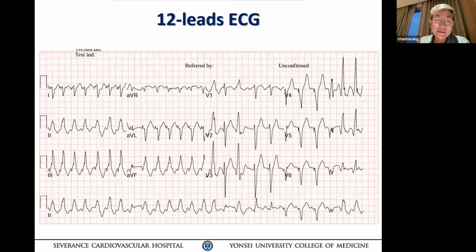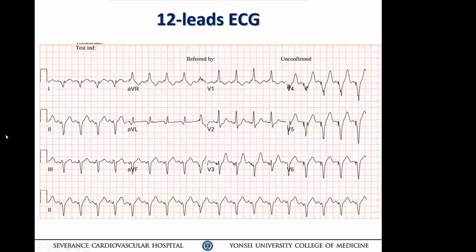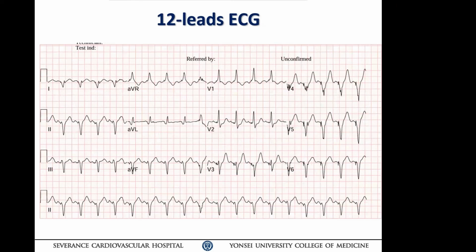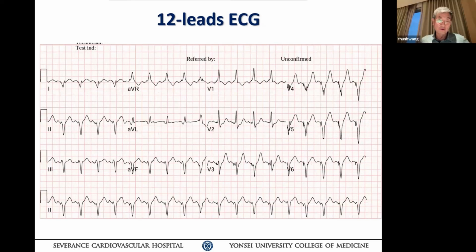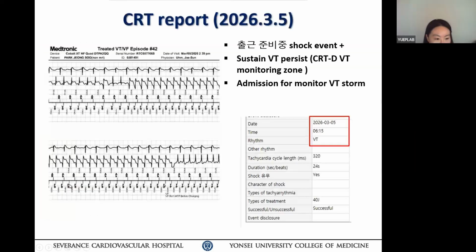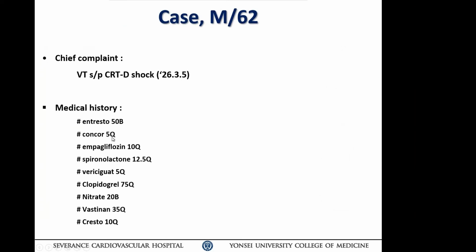Can we see the next ECG? Okay. Yeah, this is a sinus rhythm. In this patient, see, lead 1 is completely different. Lead 3, still it is pretty fast, right? Yeah, but not as fast as the first one. So there might be ectopic atrial tachycardia going on simultaneously, I think. Is the patient taking a beta blocker with enough dose? Bisoprolol, 5 milligrams.